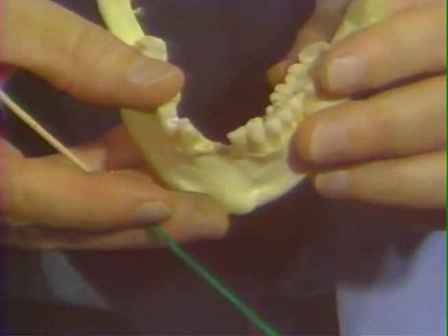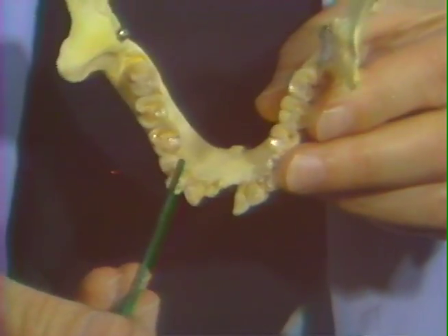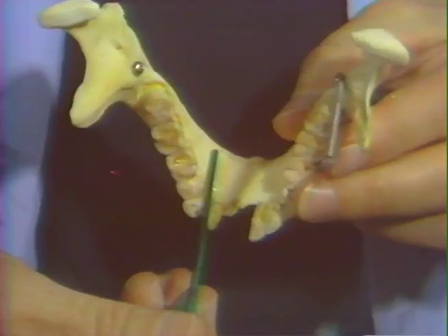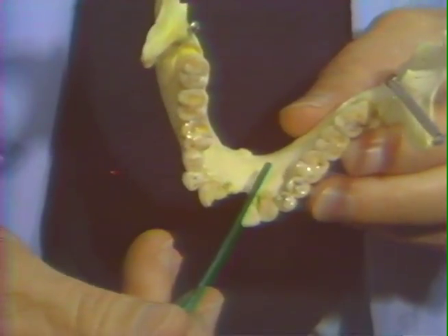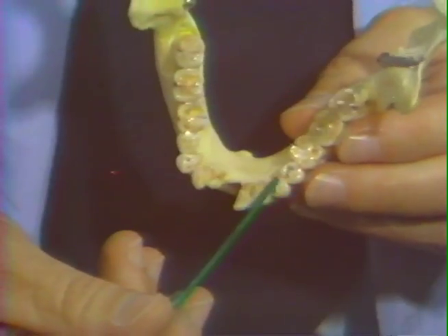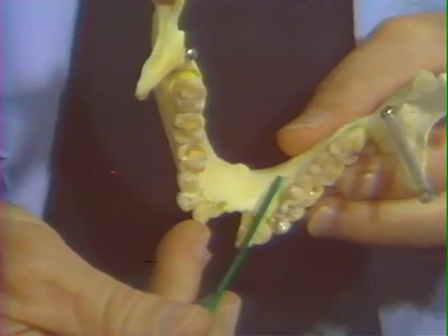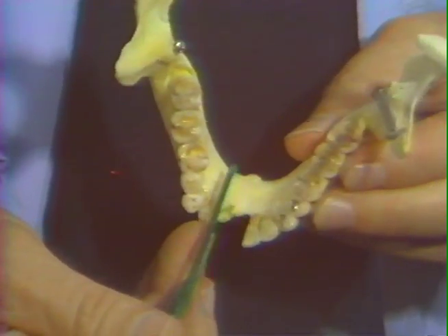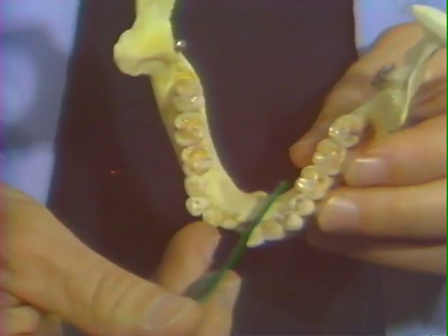The anterior branch of the lingual nerve may be infiltrated in the floor of the mouth on the right and left sides by penetrating the mucosa of the floor of the mouth in the area of the first bicuspid tooth and produces anesthesia of the lingual nerve, right and left sides, anterior part, floor of the mouth.